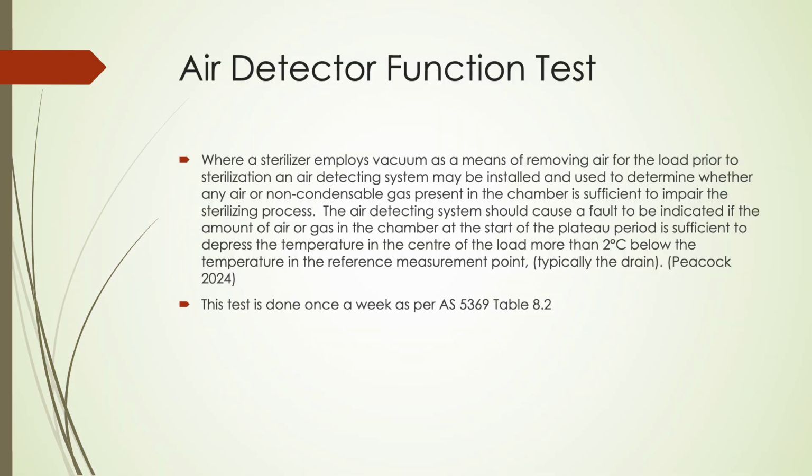The next performance test would be the air detector function test. It's a cycle where the sterilizer introduces air or non-condensable gas to the chamber at a certain level that could interrupt the cycle when the air detector system alarms. This indicates that the steam cannot penetrate the chamber due to a high level of NCG, or non-condensable gases.